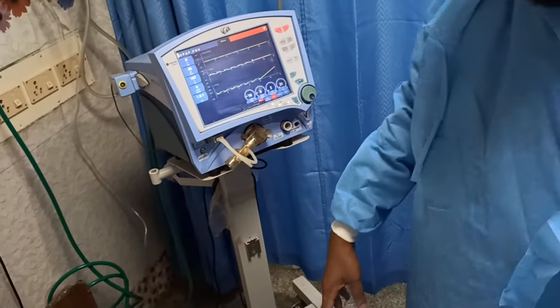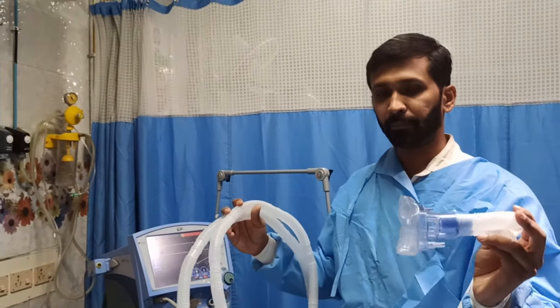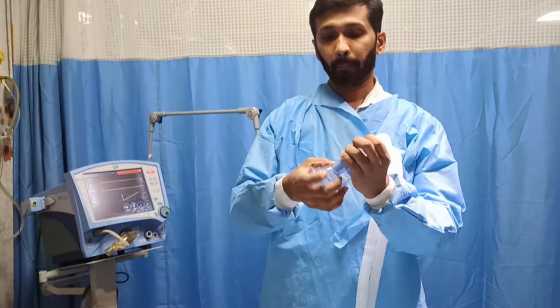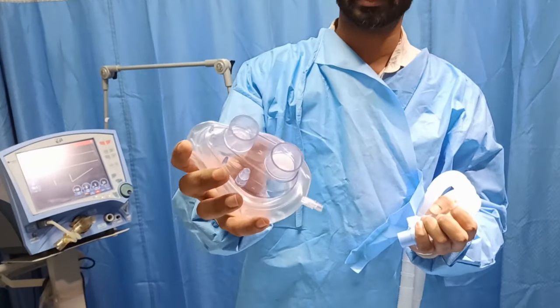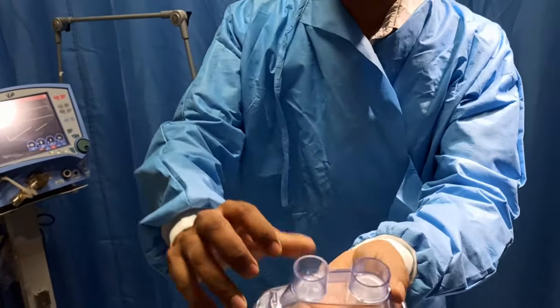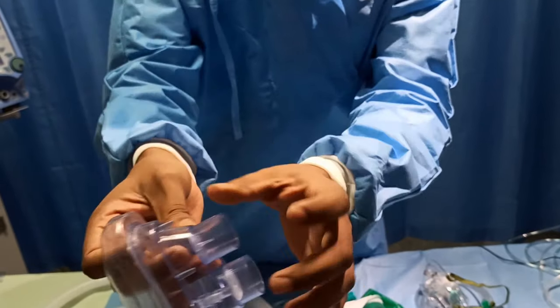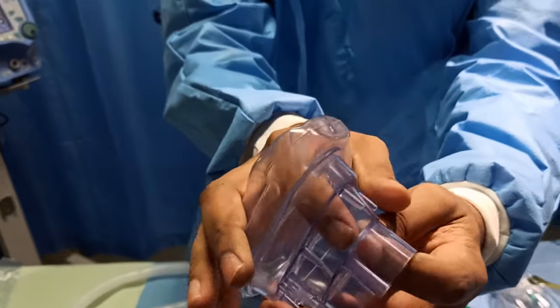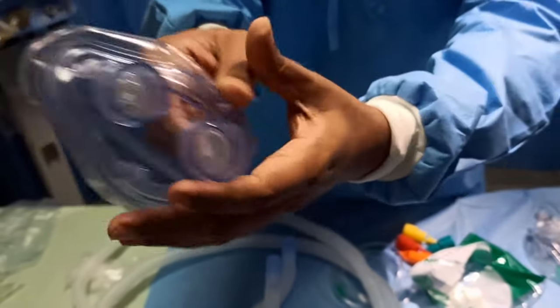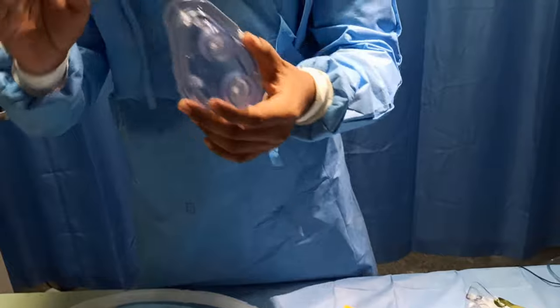Now we will see how to connect a CPAP tube to our CPAP. This is the CPAP mask and the tube we are using here with our ventilator. This is actually a biport mask, not a single hole. It has an inspiratory side and an expiratory side. Just be careful that there are two valves. This is the inspiratory valve. Inside you can see that this valve is opening inside. That means if air goes through this side, it will allow it to go inside. If you are connecting here, you can see another valve, this expiratory valve. If you connect it opposite, then both valves will be closed. I will show you what happens when you connect it the wrong way.